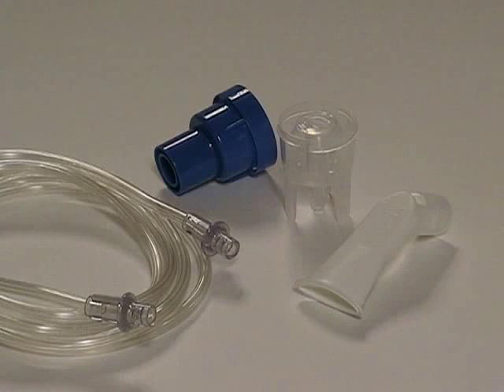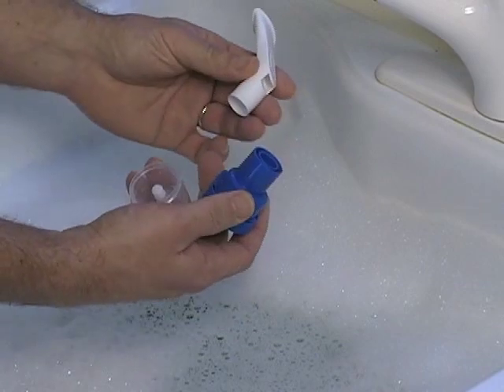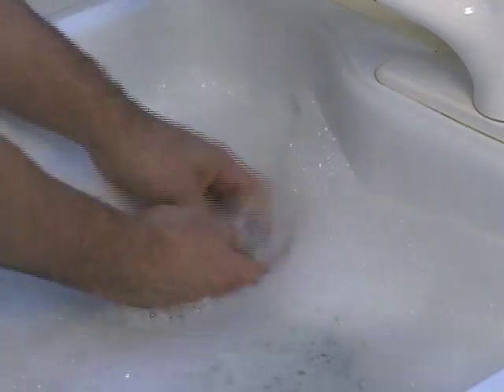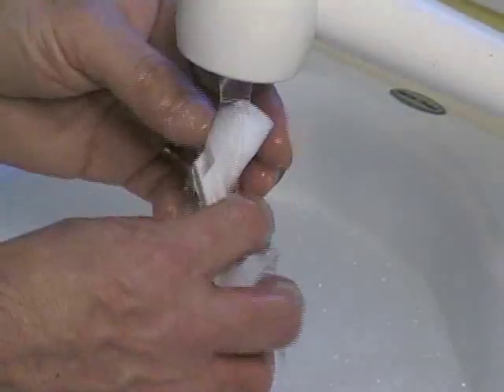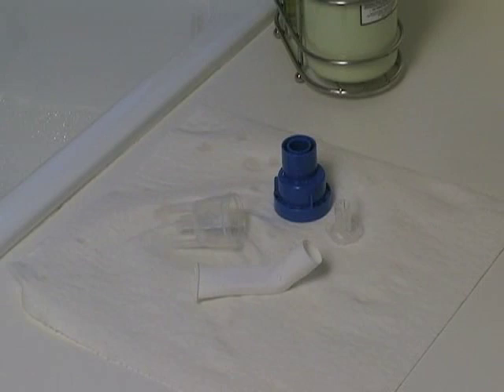The nebulizer handset must be cleaned between each treatment. Remove the plastic tubing from the medicine cup and compressor. Do not wash the tubing. Take the nebulizer handset apart and wash all its parts in warm, soapy water. Rinse the parts in clean water, making sure all the soap is rinsed off. Let the parts air dry. You may also place the disassembled parts in the top rack of your dishwasher.